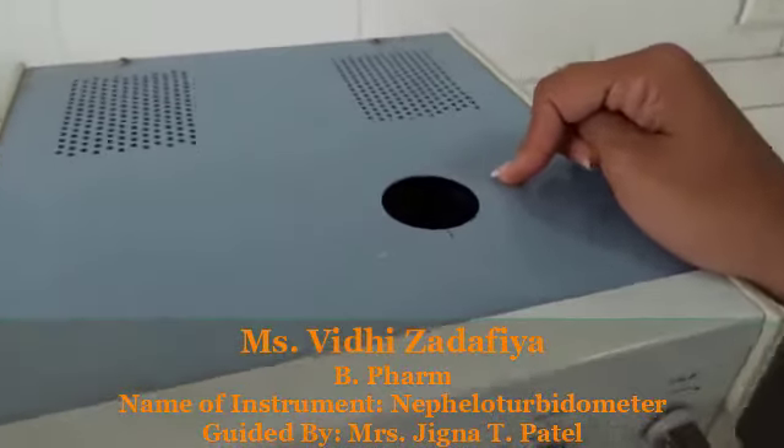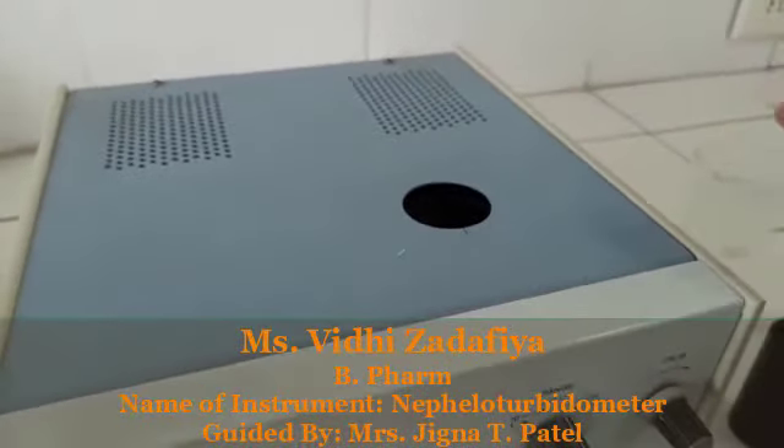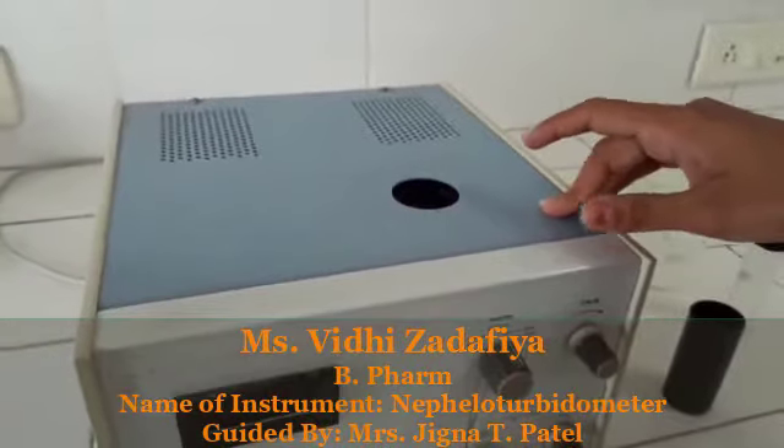Here is the placement of the cuvette. In this instrumentation, on this part, we can use this cuvette by which we place our sample and that will give the reading.